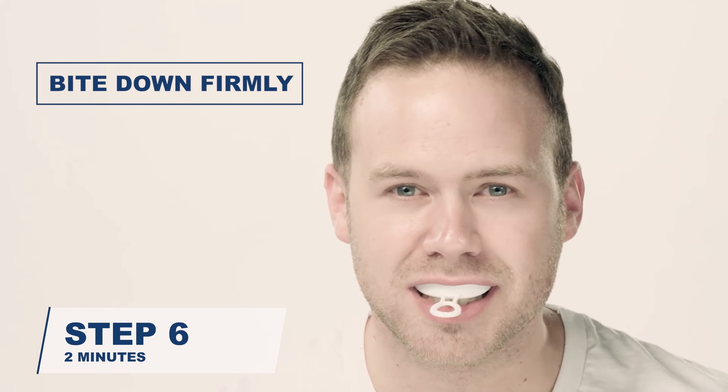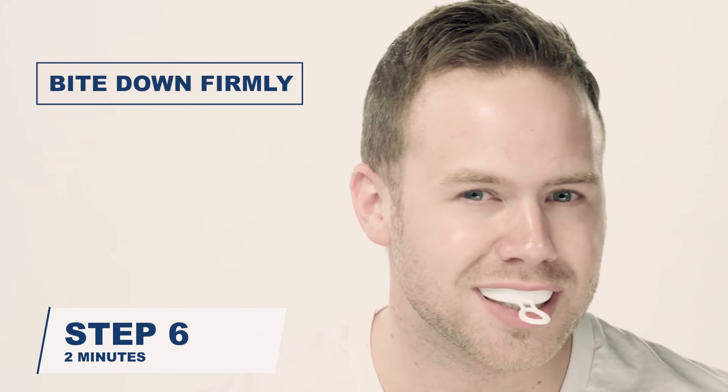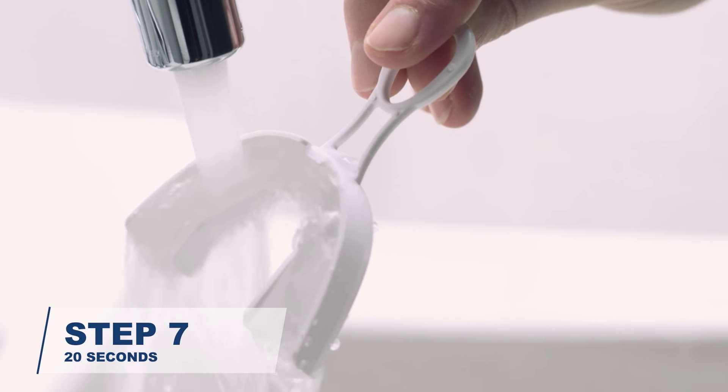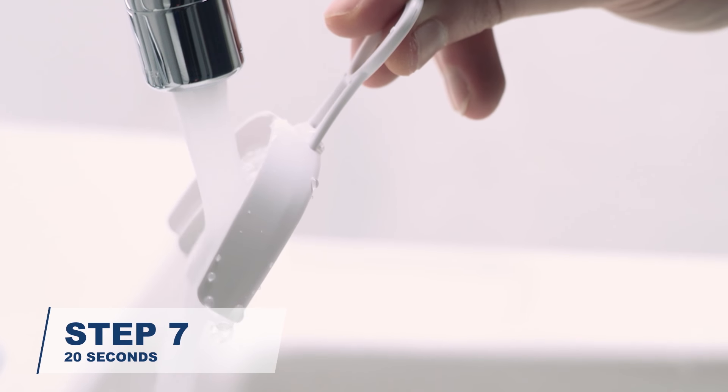Relax your bite, but keep the guard in place for at least two minutes while the material hardens. Gently remove the guard and tray from your mouth and rinse under cool water for at least 20 seconds.